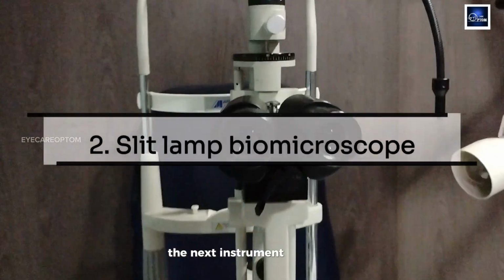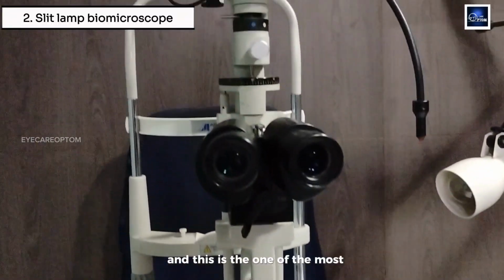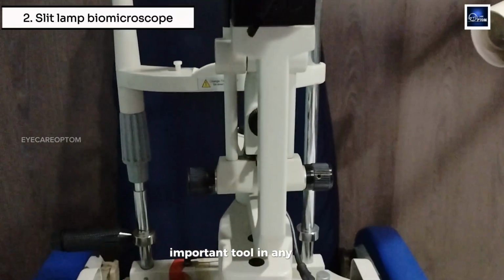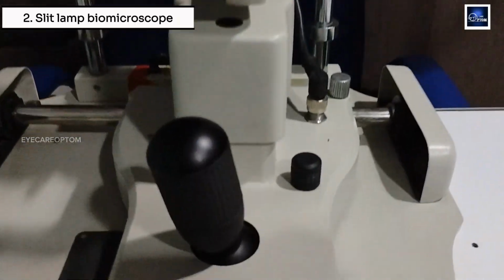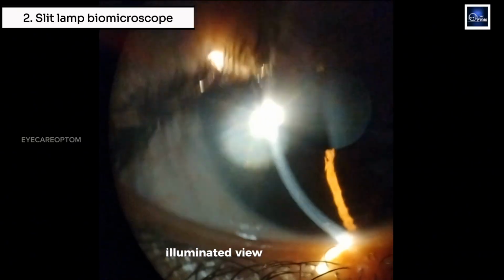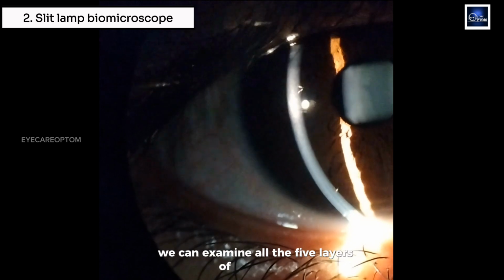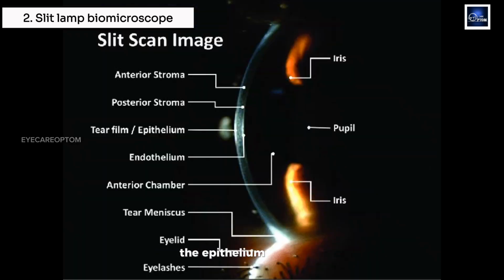The next instrument is the slit lamp biomicroscope, and this is one of the most important tools in any corneal examination. The slit lamp gives us a highly magnified illuminated view of the cornea layer by layer. Using the slit lamp, we can examine all the five layers of the cornea: the epithelium, Bowman's membrane, stroma, Descemet's membrane, and the endothelium.